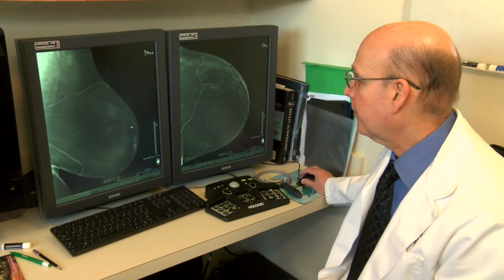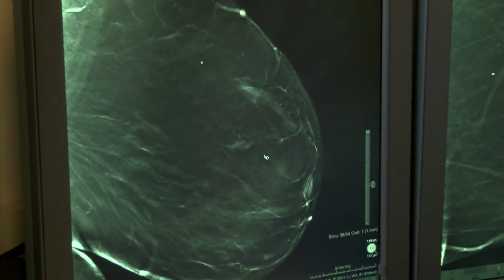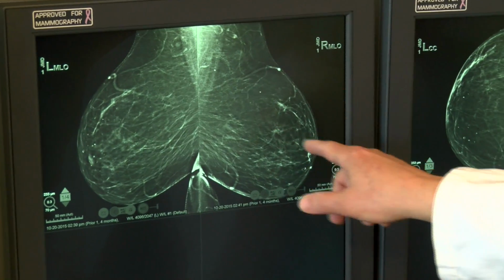The 3D mammogram technique or tomosynthesis helps not only in detecting breast cancers but also has decreased the recall rate. There have been multiple studies throughout the United States in multiple hospitals, and over 100,000 patients have been reviewed. And the research has shown that 3D mammography increases the detection of all breast cancers approximately 15%, and most importantly, the 3D technique combined with the traditional 2D technique increases the detection of the most serious breast cancers, the invasive breast cancers, by up to 40%. That's a big difference. And so in addition to increasing the detection rate, the 3D technique reduces the recall rate.